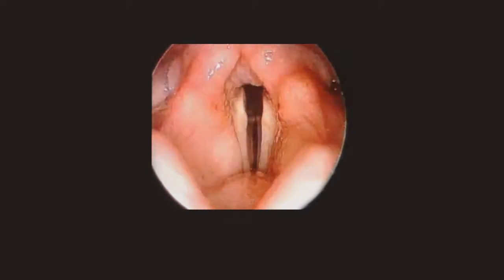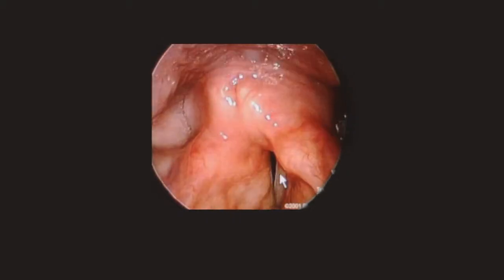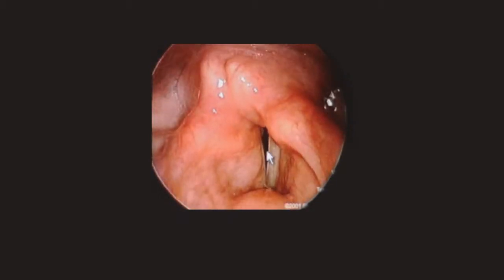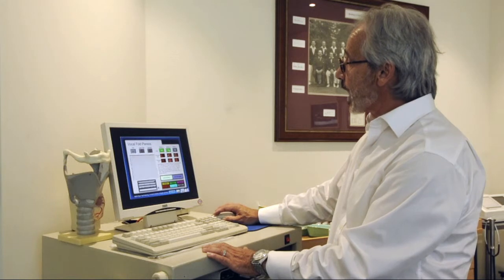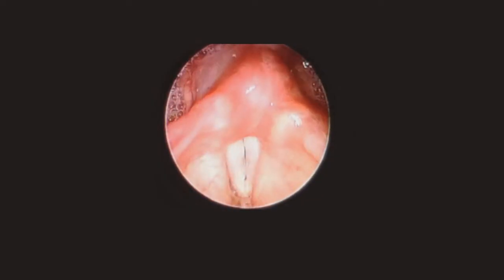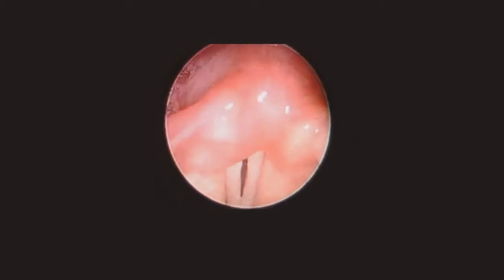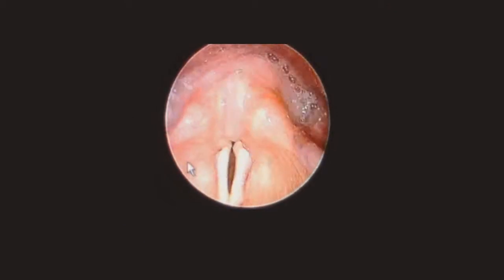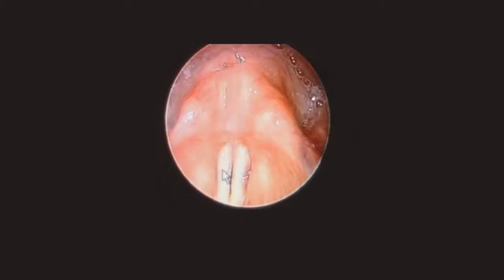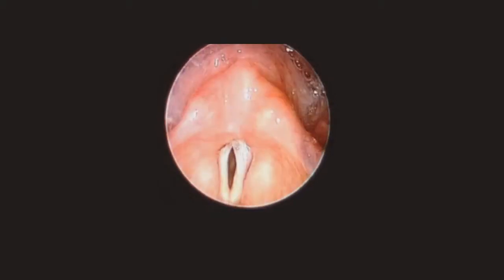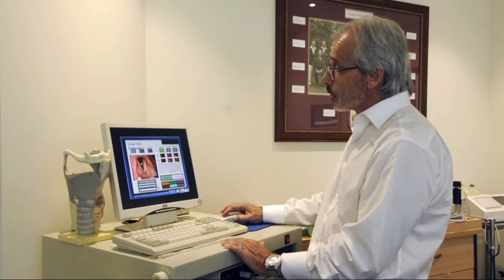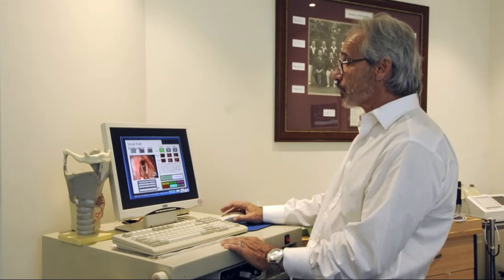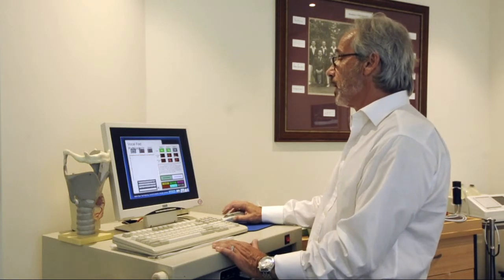One of the most common neurological conditions we see in the larynx is altered movement of the vocal folds. This patient has a paresis with reduced movement of one vocal fold, and you can see that when the vocal cords come together there's a gap which allows air to escape — the reason for the generally breathy and weak voice. On stroboscopic examination, you can see that there's much more movement in one vocal cord than the other, and in patient three there still remains reasonably good compensation and good voice. When this paresis or weakness becomes a paralysis, there's a lot of wasting of the vocal cord and the gap between the cords is much greater, so the voice is much weaker and much breathier.